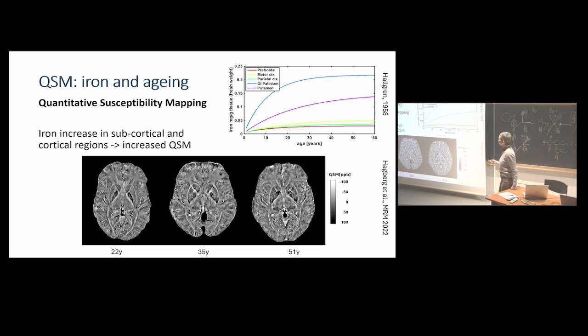And that is a very, very nice technique, because we know from a very long time that the brain tends to accumulate iron. So we need it to do myelin, and we need it for a lot of things, to do good blood, etc., but we cannot get rid of it. So with increasing age, it does stop at some time. Yeah?